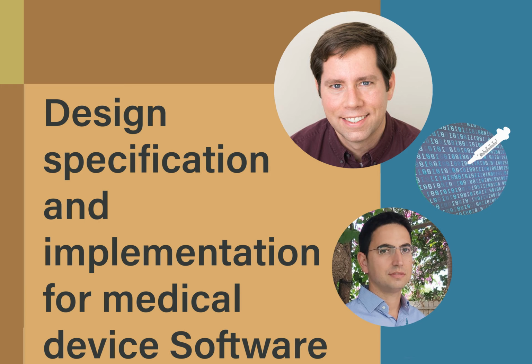So once we are coding, what do you advise companies? Do you advise them to keep a coding standard? There are so many engineering practices like static code analysis. What are your minimum expectations or advice for medical device companies when it comes to the technical side? Right. I would absolutely recommend a coding standard.